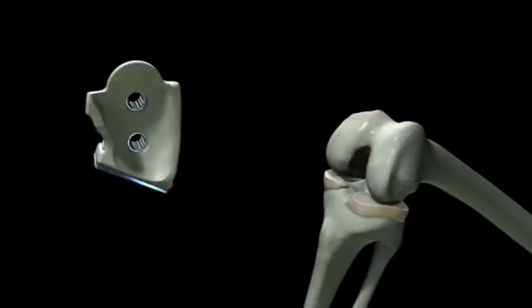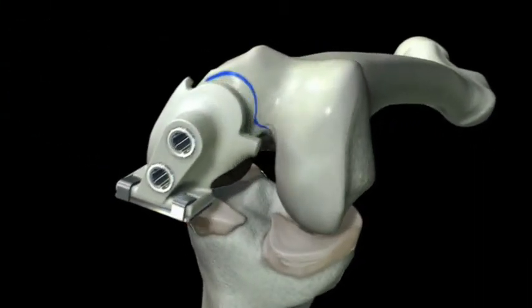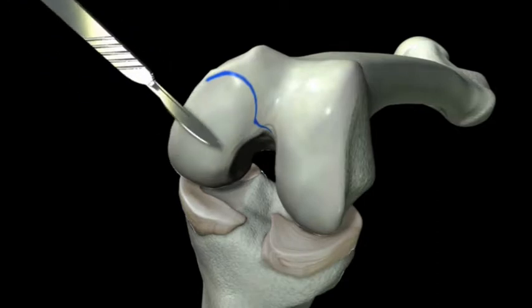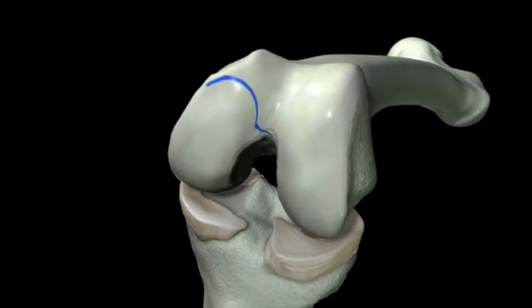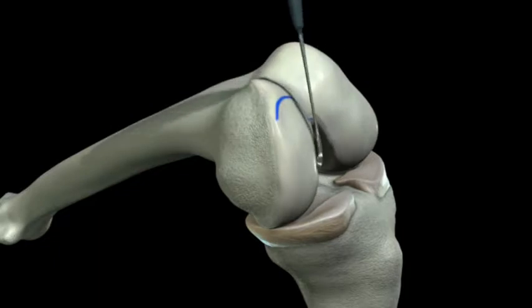Step 1: Cartilage removal. Place the femoral IJIG on the condyle and mark the anterior edge of the femoral IJIG. Remove all cartilage posterior to this mark, including the posterior condyle, using a 10mm blade and a curved elevator or an osteotome. Finish cartilage removal using a 5mm ringed curette down to subchondral bone.